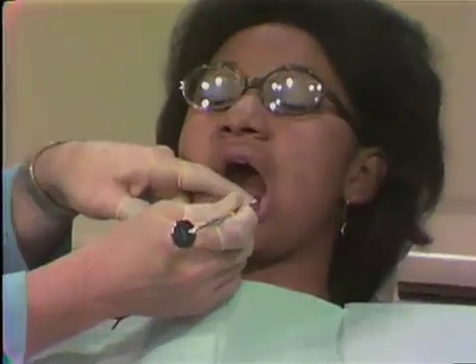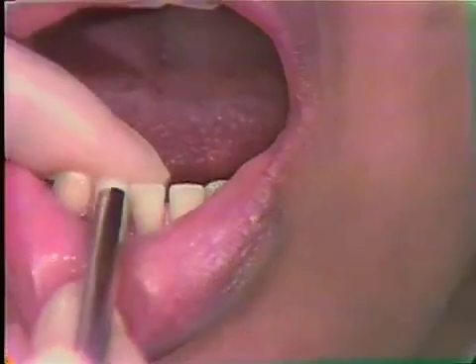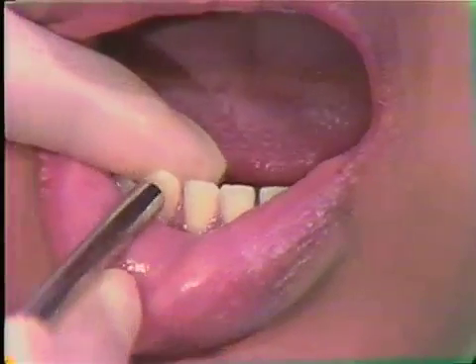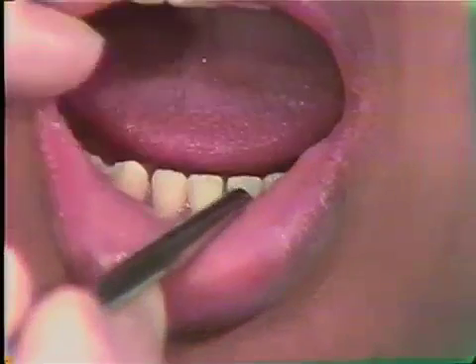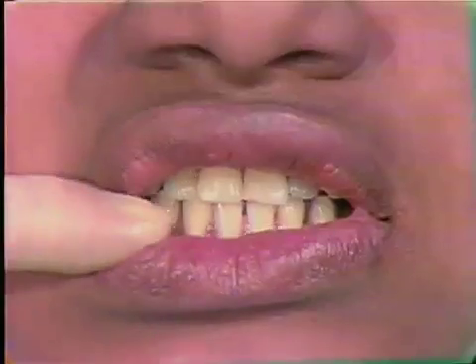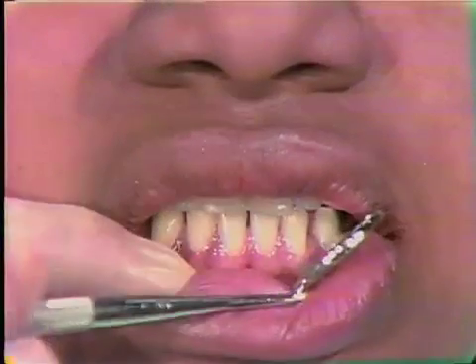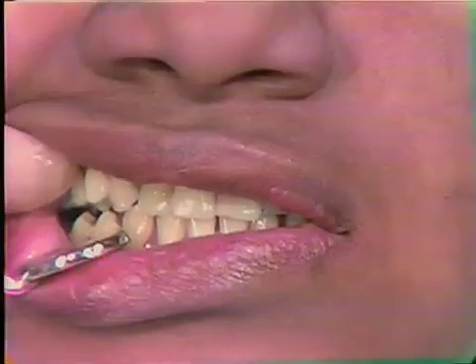Sometimes, because of the opening and loss of contact in the anterior, with a patient wearing an appliance like this most of the time, there will be extrusion of the anterior teeth. However, that does not appear to be the case with this patient.